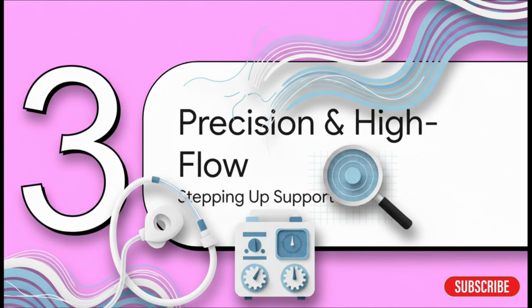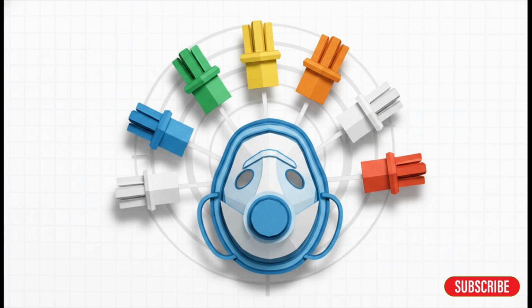So, we've covered the foundational tools. Now let's level up and look at some devices that offer a higher degree of support and something else that's incredibly important: precision. This is the Venturi mask, and I want you to think of it as our precision instrument. Here's a little trick. The V in Venturi stands for very accurate. Its whole purpose isn't just to give oxygen, but to give a precise, exact concentration of it.